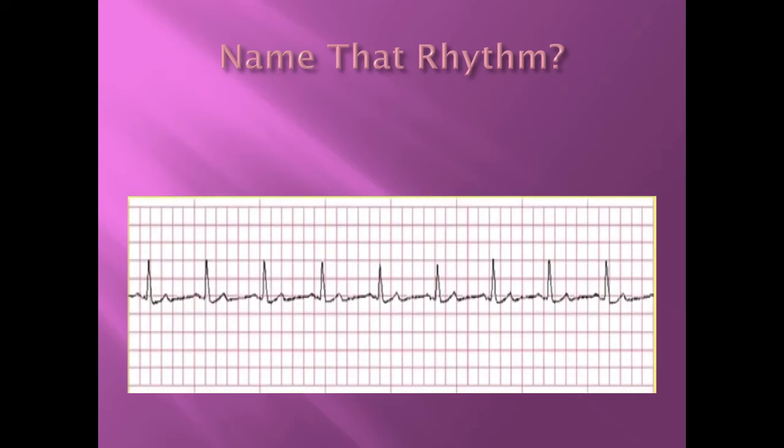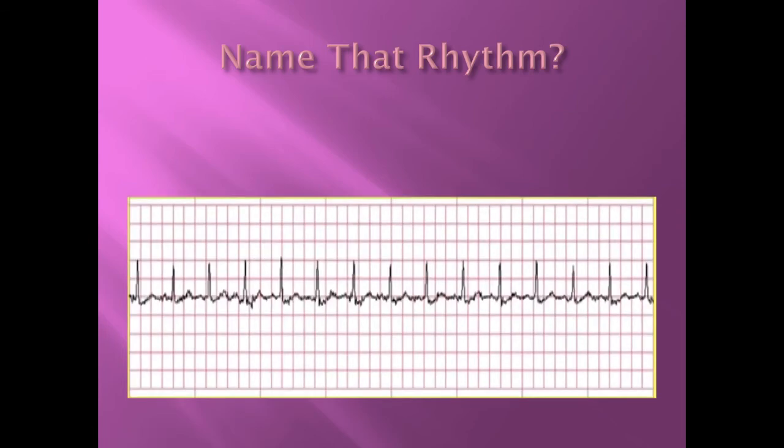This is also a normal sinus rhythm, but there's a little bit of artifact, and the P waves aren't as prominent. That's fine, because they are there, all right? It's very consistent.